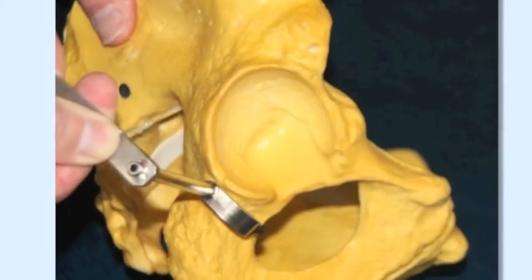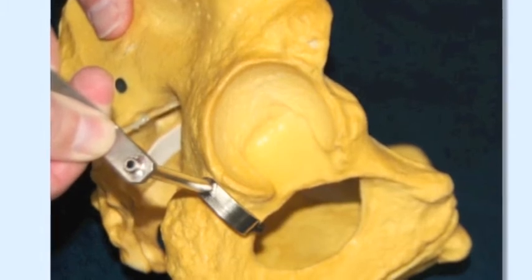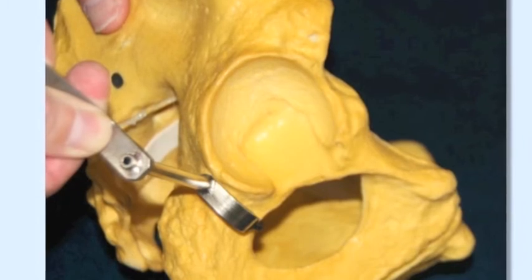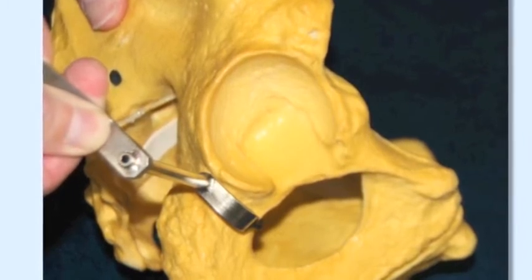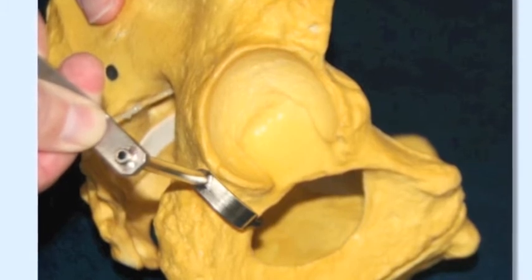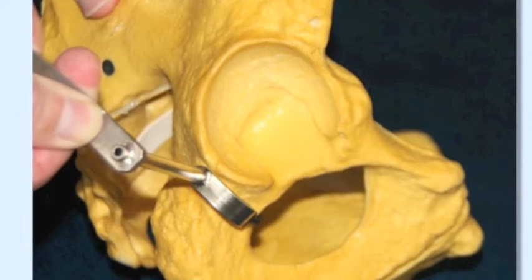Once the acetabulum is reamed and the cup is ready for implantation, the base point pin should be inserted. Understanding the process of placing the base point pin is the most critical aspect of using the HipSextant. In order to find the correct location for the base point pin, a calibrated drill guide is used.